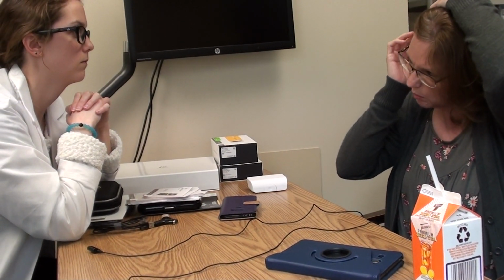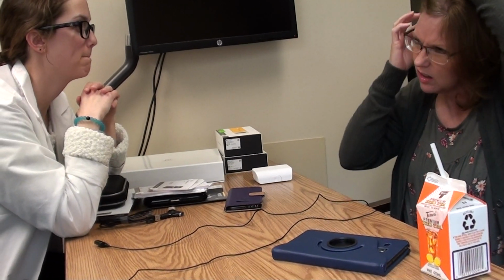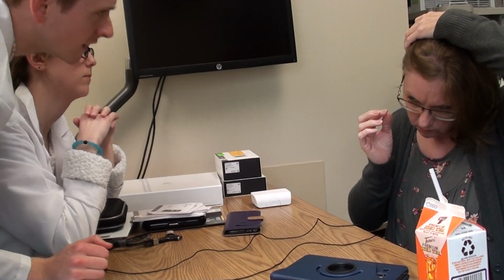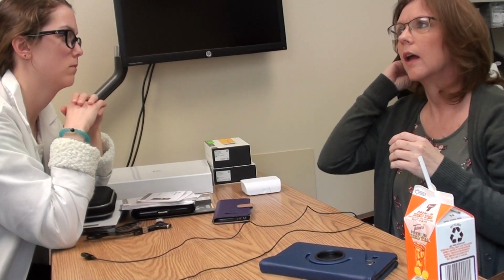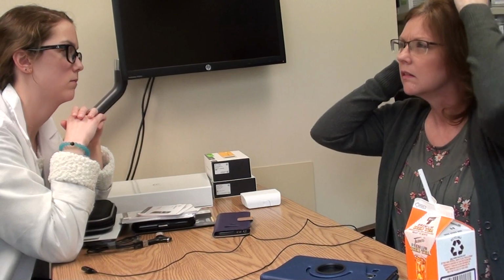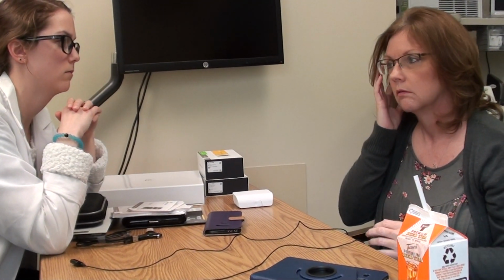I'm shorter a little bit. You want the tubing shorter? The too long. Is that okay? That looks pretty good actually. Okay. I mean, we can shorten it if you want, but that looks like how it should. Okay. It just feels different because that hook on the implant's different. But that actually looks like the right length. Yeah. It's not pulling or anything.